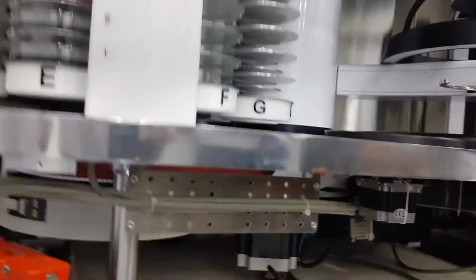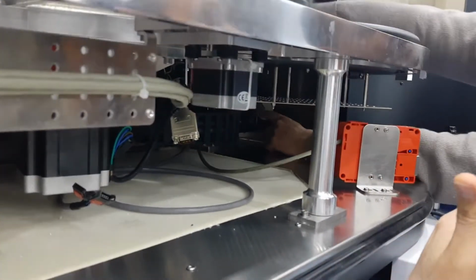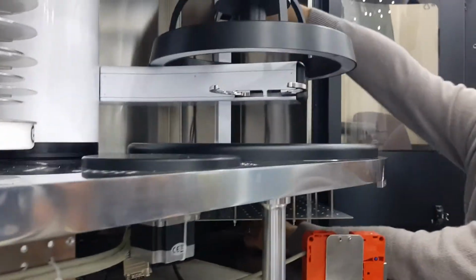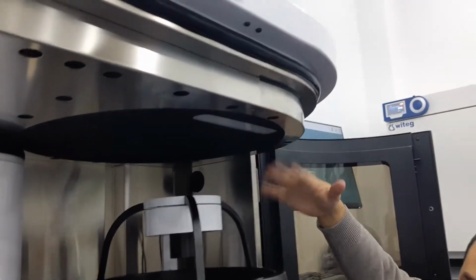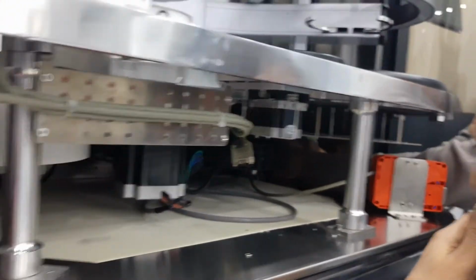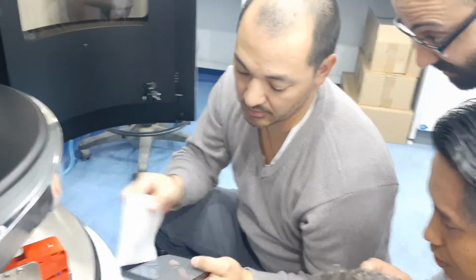There's the fans there. Actually, the air goes inside through all the holes, and then the fan pushes the air up in there and there. Here in this chimney, you have the Peltier element, and then it goes back up, and that's only a diffusion plate, a plate with holes. But here there's the filters. You can unclip them, and that's it. And just change them if they're a bit black.